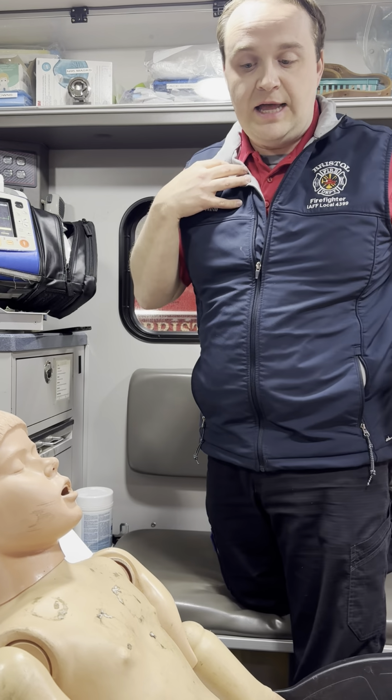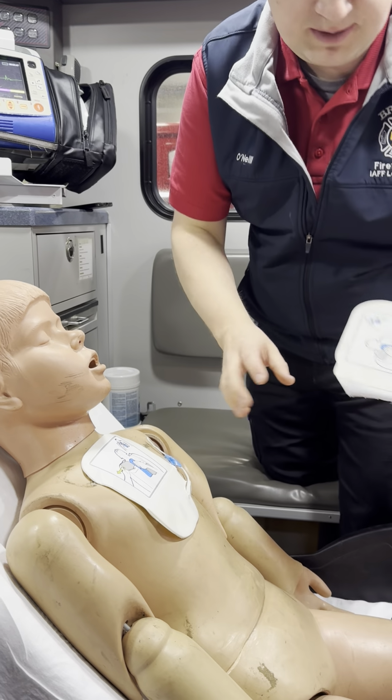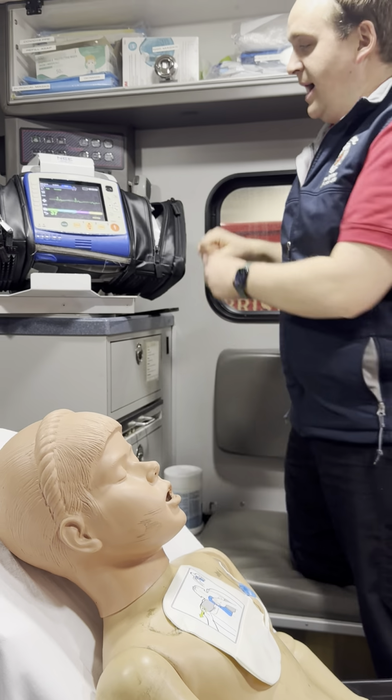Pad placement, you have two options. You have the anterior lateral or anterior posterior. Anterior posterior does seem to be preferred for the pacing, so we'll do anterior posterior pad placement. We'll plug our pads into the connector.